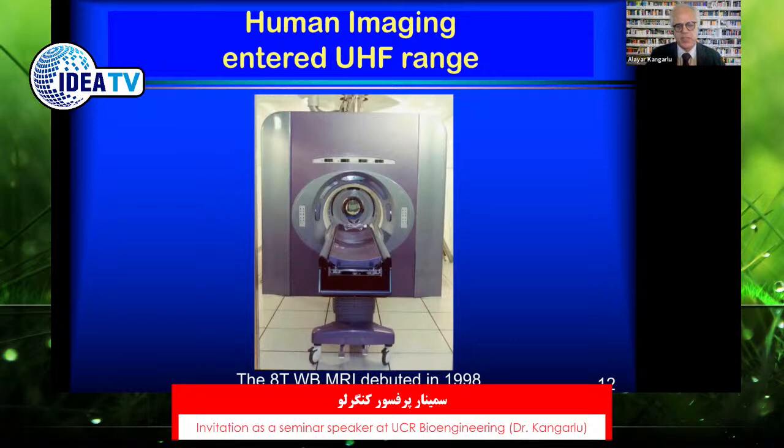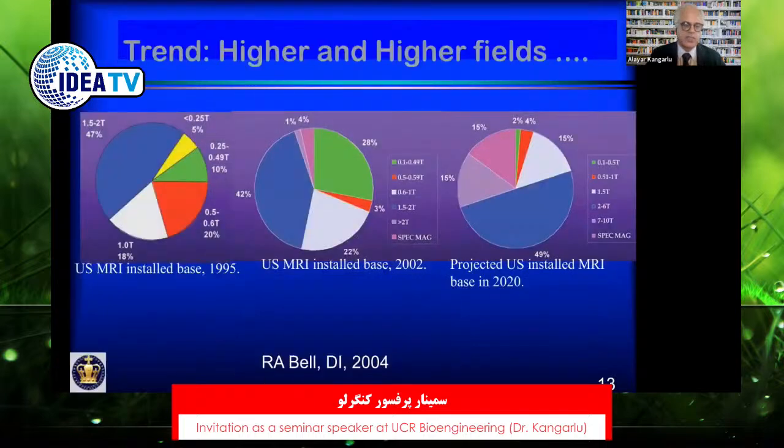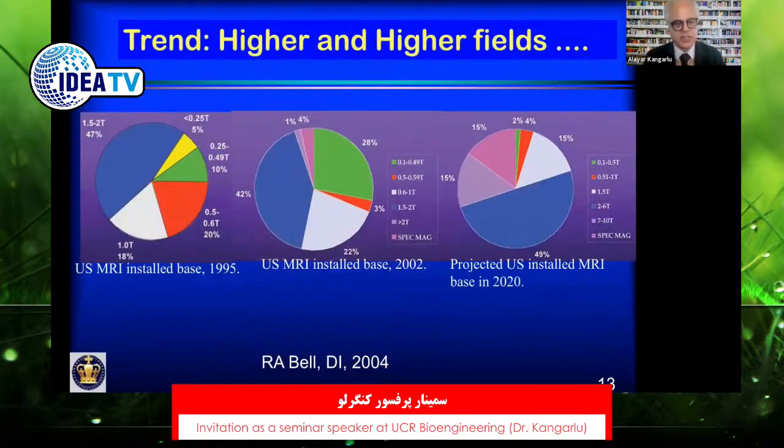We had something like 13 different departments of engineering and science at Ohio State involved in the magnet. And in 1998, when we produced the first high-resolution images of the brain, it really was the pride of the institution, shared by almost every department of science and engineering. Even the Department of Art was involved in the design of the color combination of the gantry and the table.